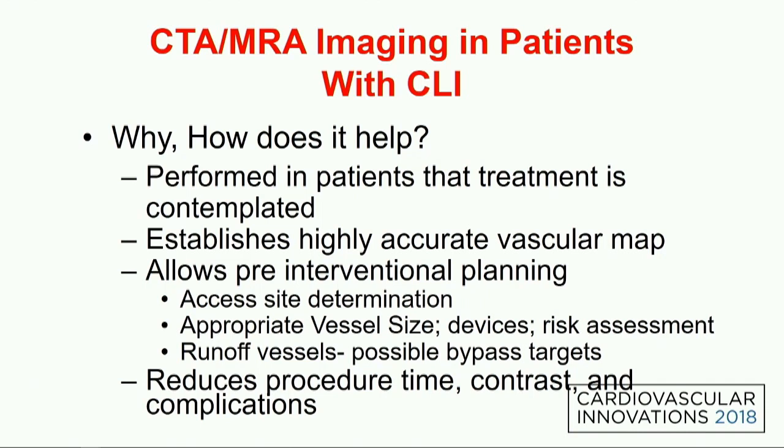So when do I acquire these CTAs and MRAs? So many people say, Tino, I don't understand why you get so many CTAs and MRAs in Miami. Why do you do this? And I think it's why. The questions are why and how does it help? Really, it's important to look at a treatment map. We look at it to really understand the extent of disease, and it may not tell us the tibial and pedal disease, but it will definitely give us an idea of the inflow disease and help us plan our treatments.